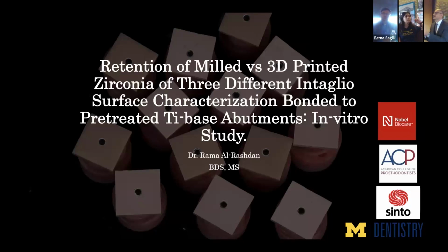What we are talking about is a resin reinforced ceramic, however they change the name. It's kind of a hybrid, and the first patent was rejected 15 years ago. It was from our group, that we basically infiltrated the resin inside the porous ceramic. But that's not the definition of ceramic. That's a hybrid material, and that's in the market.